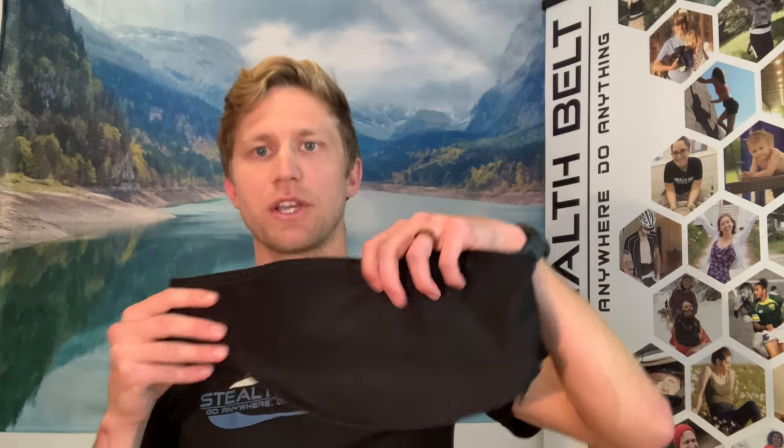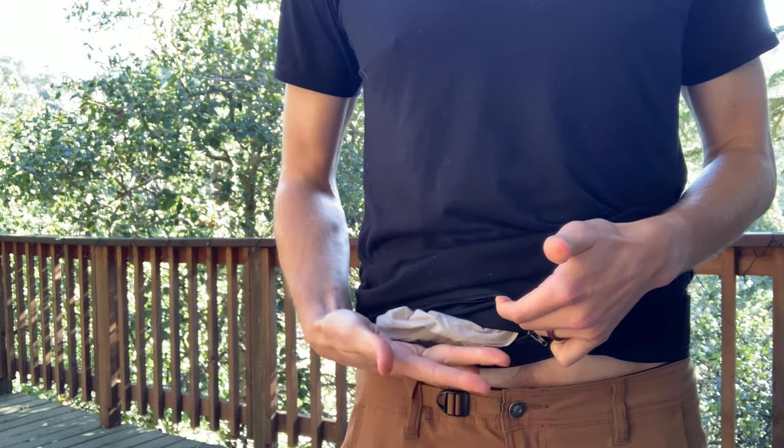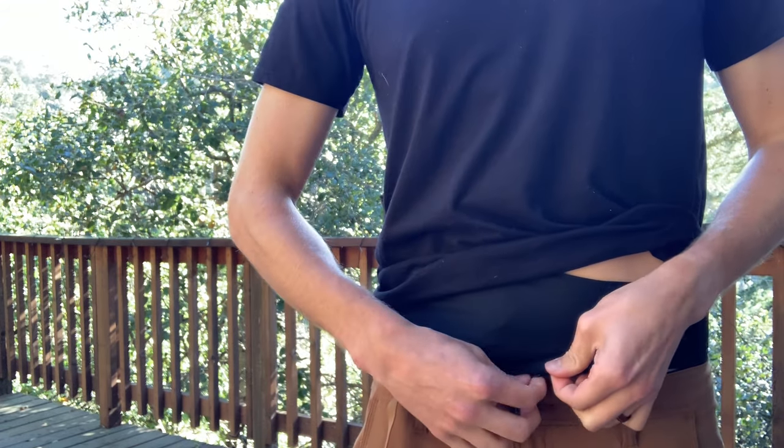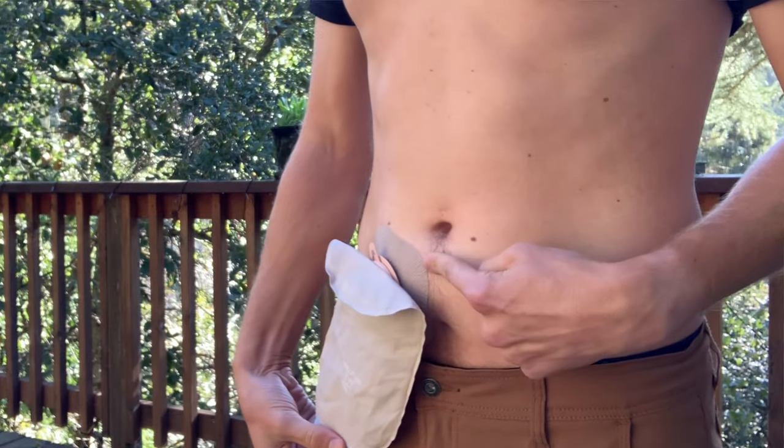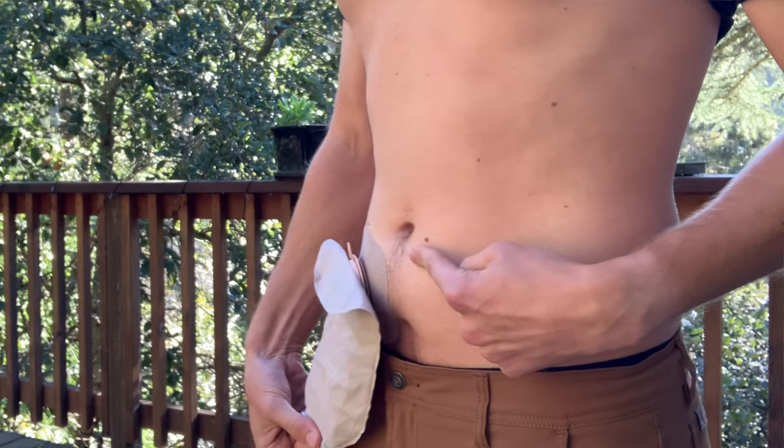One of the ways it actually helps prevent leaks is by having the Stealth Belt hold the appliance on the inside. As the appliance fills and gains weight, that weight is held up by the belt rather than relying on the adhesive to do it. So even if you can't immediately empty your bag, that weight is supported — and with a free-hanging heavy bag, you're asking more of the adhesive, making it more likely to give out.